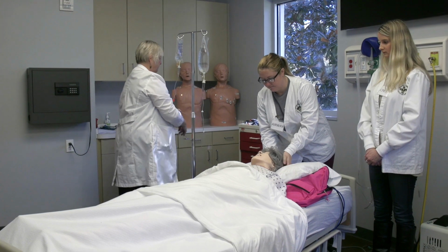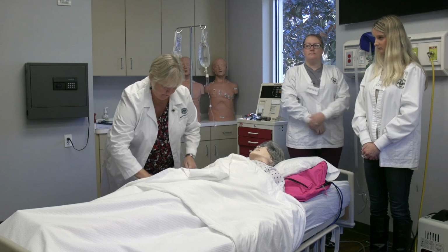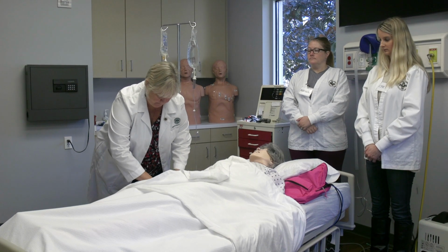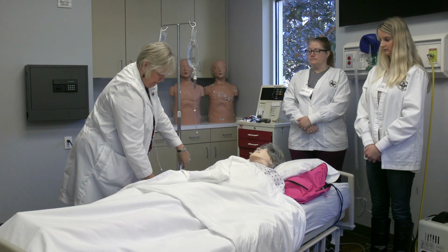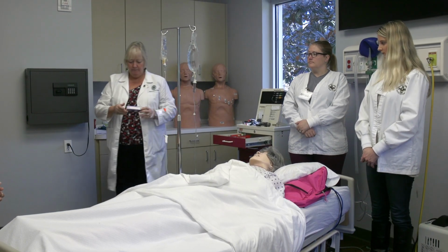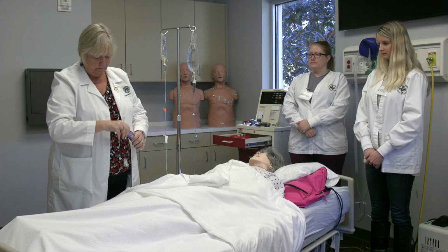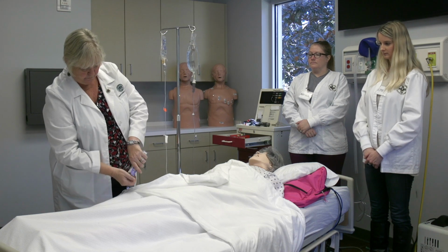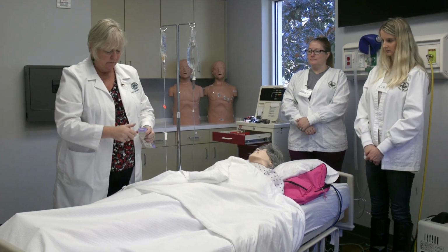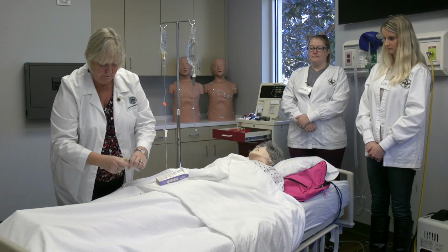With bradycardia, one of the medications I can use is atropine, 0.5 milligrams IV. I can do this 6 times for a maximum of 3 milligrams. So after the IV is established, I'd like to do the atropine. If we could have that ready, please. All right, IV's in. Thank you. And that is atropine, 0.5 milligrams, IV push. We're going to do this every 3 minutes.